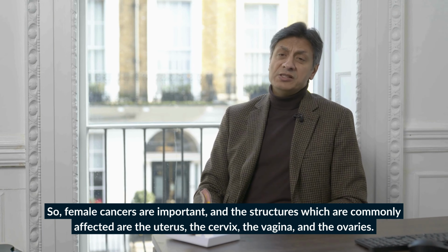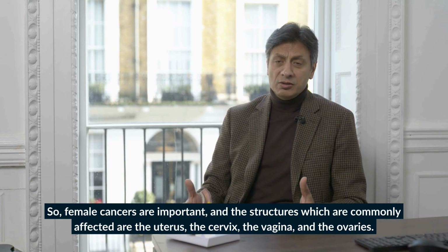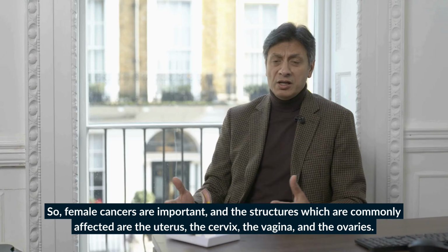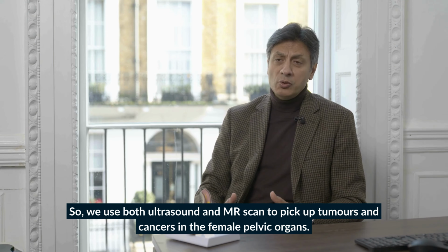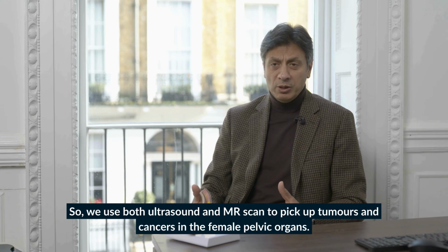What imaging do we do to look for female cancers? So female cancers are important, and the structures which are commonly affected are the uterus, the cervix, vagina, and the ovaries. So we use both ultrasound and MR scan to pick up tumors and cancers in the female pelvic organs.